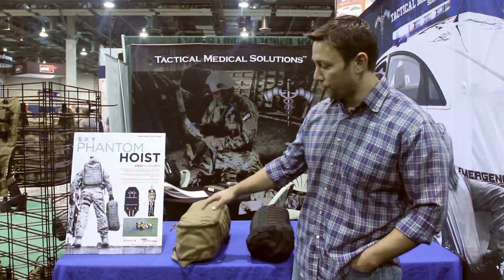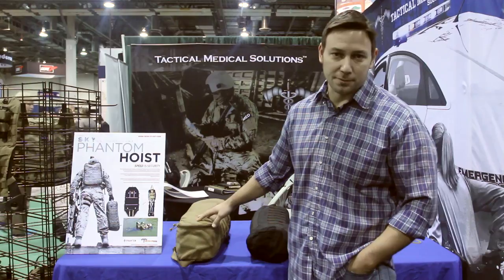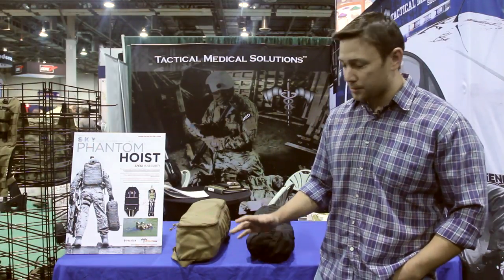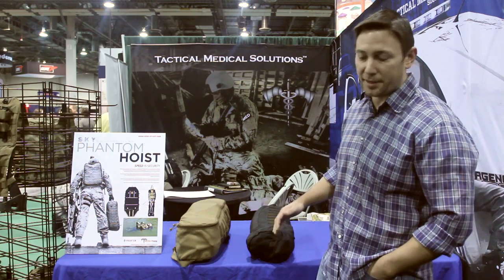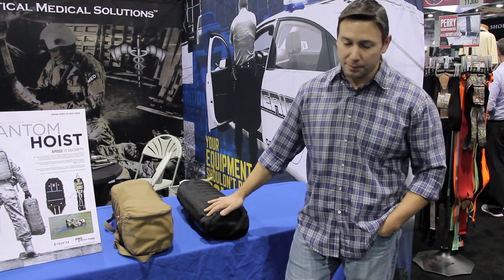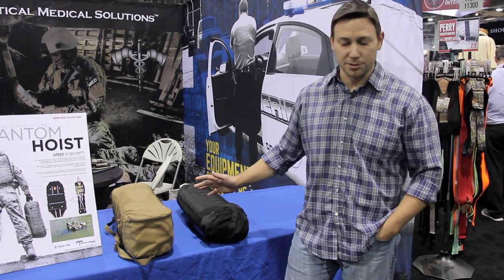Let's talk about the Phantom hoist system real quick. It's a new casualty hoist system from Tactical Medical Solutions. The background on it is the military came to us and asked us to make our Foxtrot litter hoistable, and we didn't want to just stop there — we wanted to make every litter system in the world hoistable.